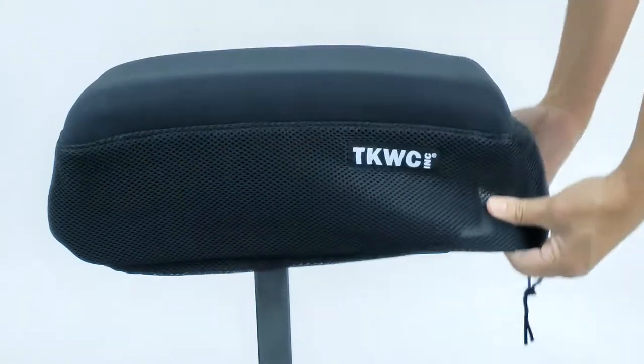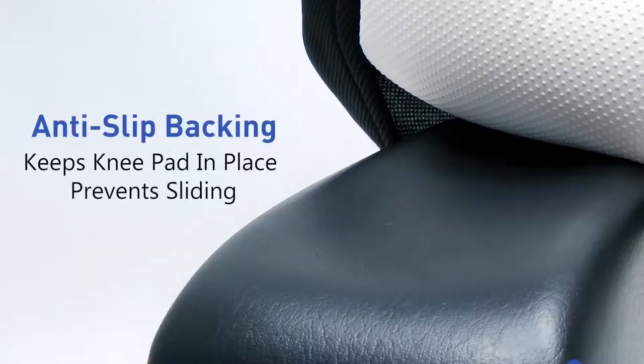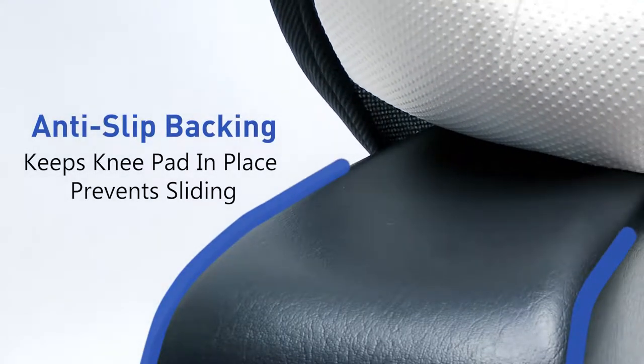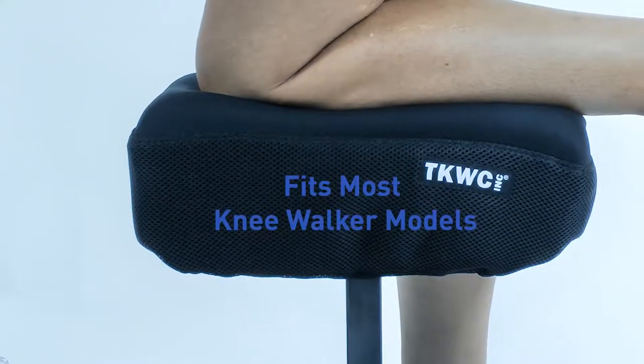It simply slips over the knee pad and secures with a drawstring fastener. The anti-slip backing helps keep the knee pad in place, preventing it from slipping during use. This particular accessory fits most models, making it one of the best knee pad covers on the market today.